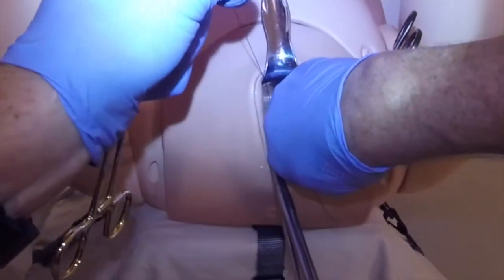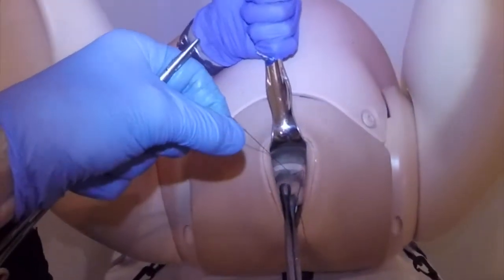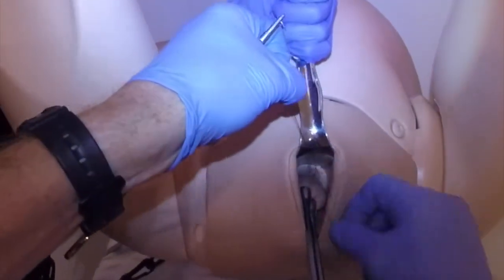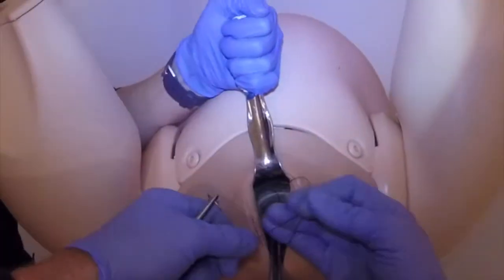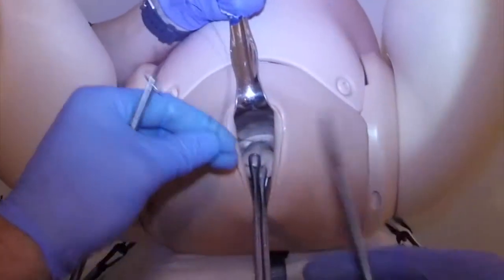I'm doing it almost but not quite as tight as I can. I'm now going to tie a square knot on the top — so one throw in the opposite direction. It's a bit slippy with this gel. Then one back in that direction to lock it down. Finally, I'm just going to cut these threads long.